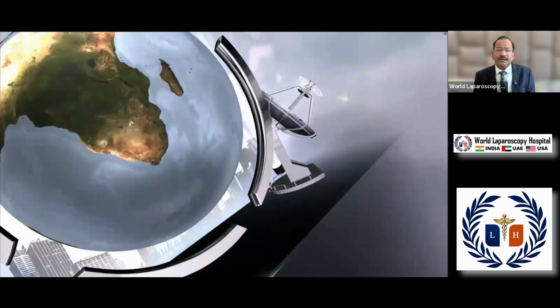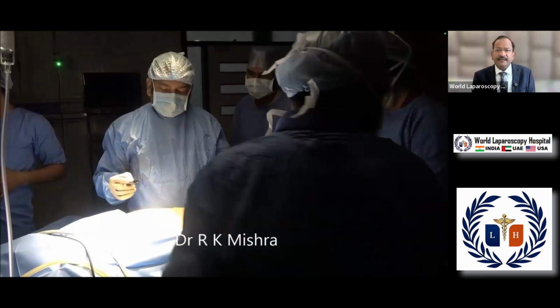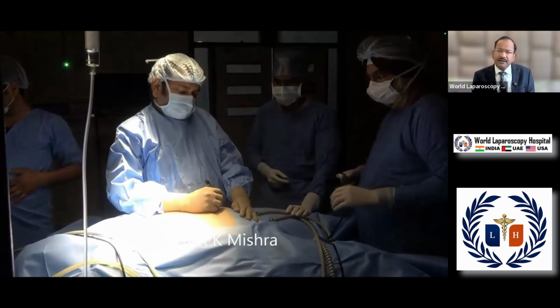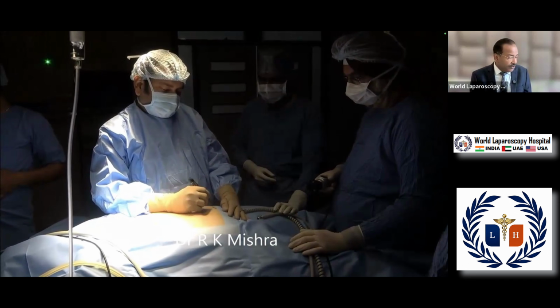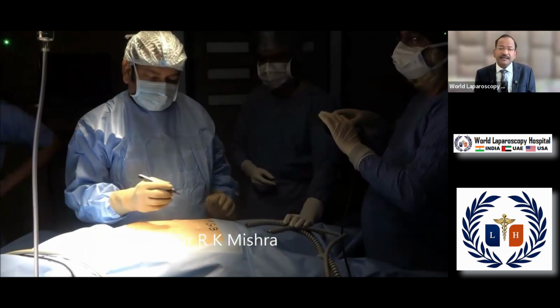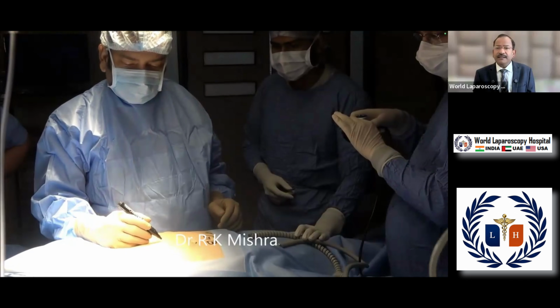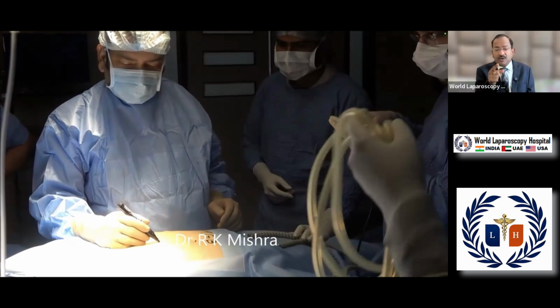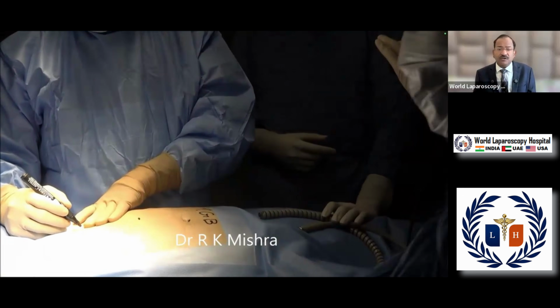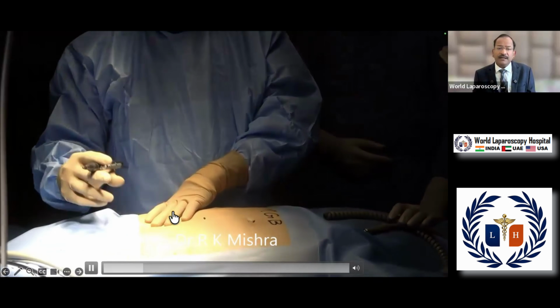Now, we will see bariatric. This is a bariatric patient and this is a mini gastric bypass surgery. Bariatric is also the same way, there is no difference, only your Veress needle should be longer. Here also the Veress needle we will put in the inferior crease of the umbilicus for insufflation. However, because it is a bariatric surgery, the trocar will go supraumbilical. The optical port will go supraumbilical.